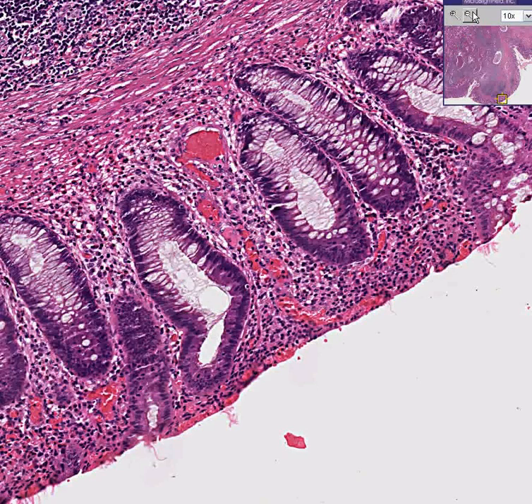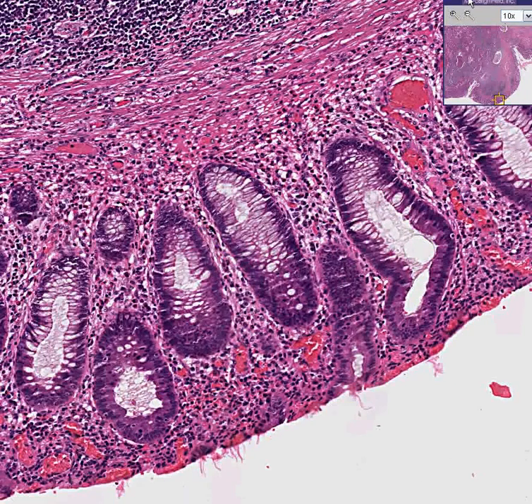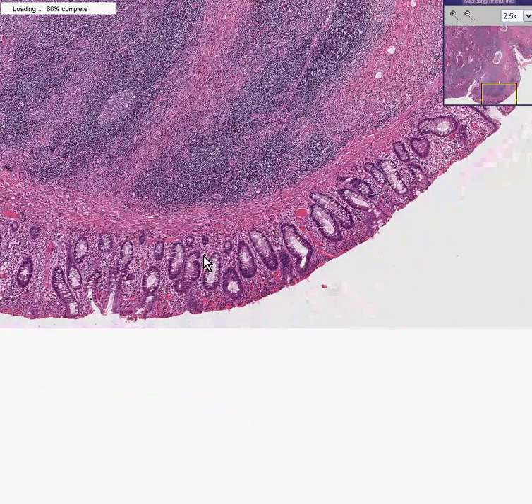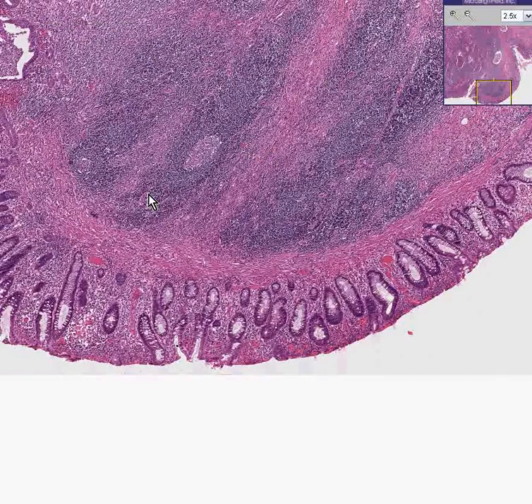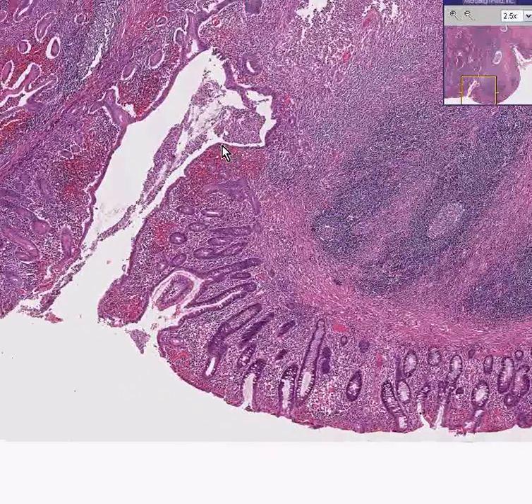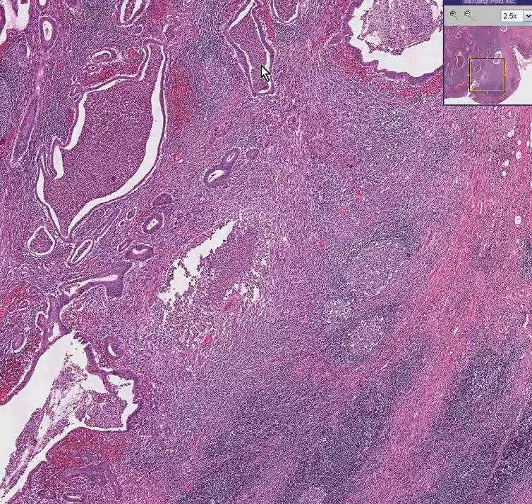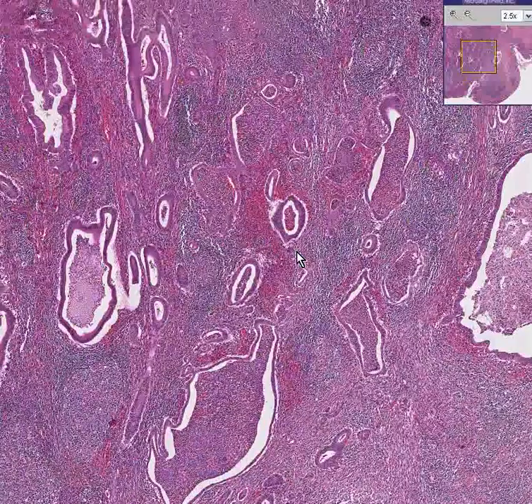And the point I want to stress with you is that long-standing ulcerative colitis is often associated with atypia and also, therefore, associated with an increased likelihood of carcinoma. And indeed, if you look deeper into this inflamed area, where you see very heavy infiltrates of inflammatory cells and lymphoid cells, as well as ulceration, you can also see that some of these glands extend beyond the mucosa and well into the submucosa. This is cancer.